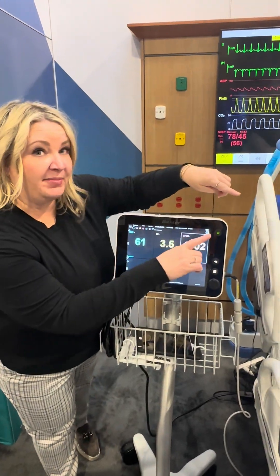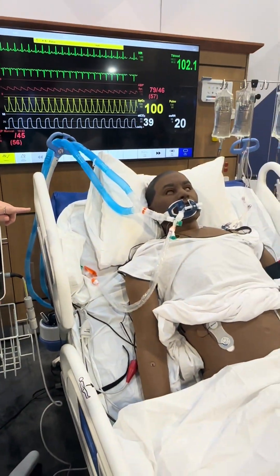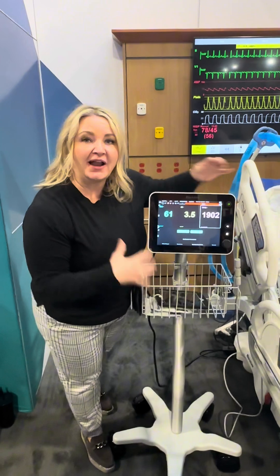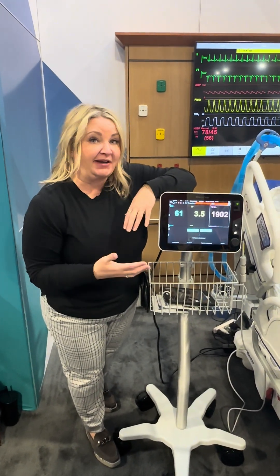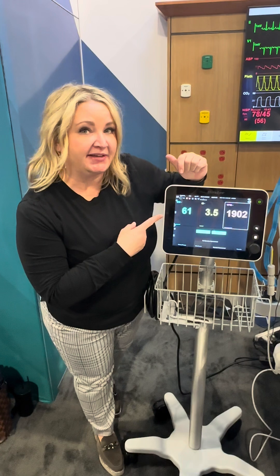Now with the head of the bed up and the legs straight, we're going to get a baseline stroke volume. I like to look at stroke volume index because it takes into consideration the patient's body surface area. Starting with a stroke volume index of 61.